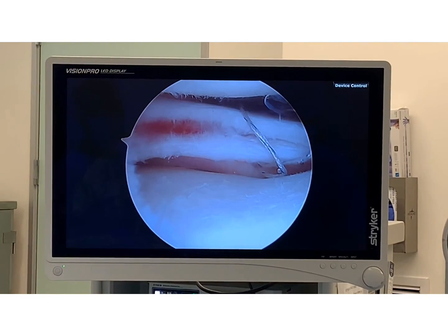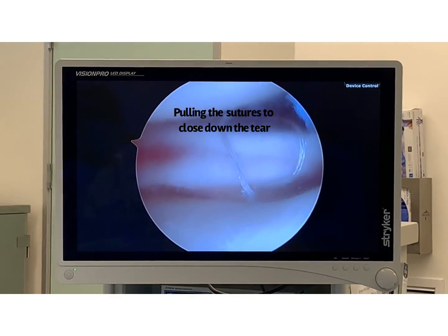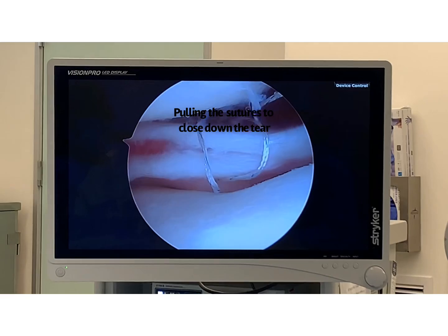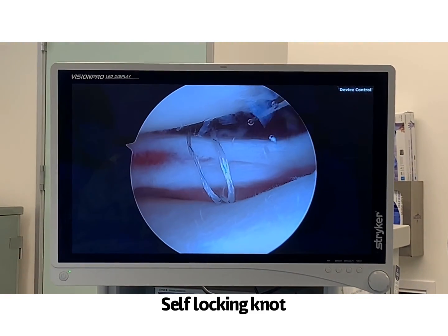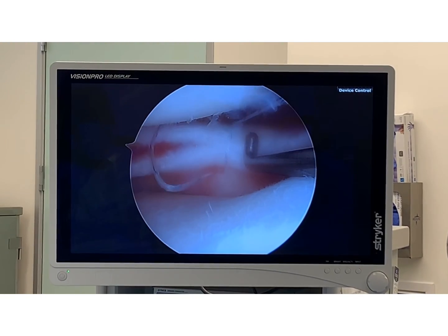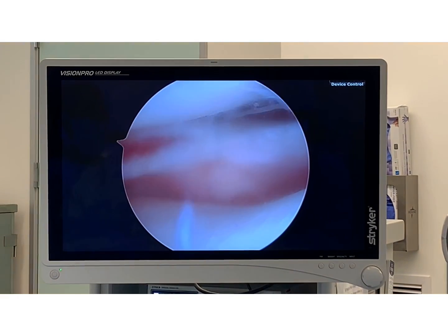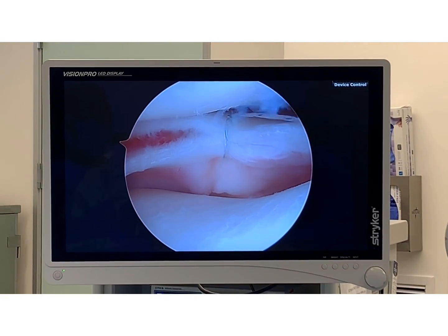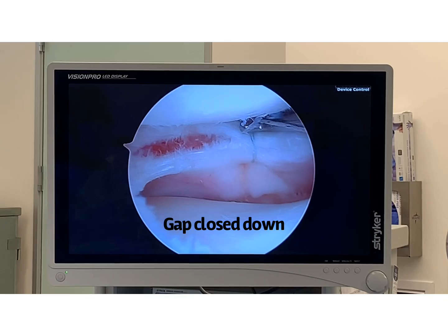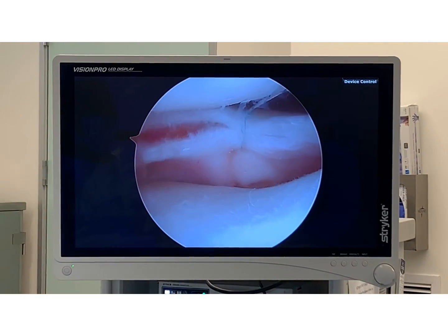There we go, like that. I'm going to put my probe in there. Let's see if this thing works — sometimes it does and sometimes it doesn't. There we go — squeezing the meniscus tight. Try to remove the knot out of the way a little bit. And there we go. I like it. So now I'm going to trim that suture and we're going to do it again. The first suture is in.